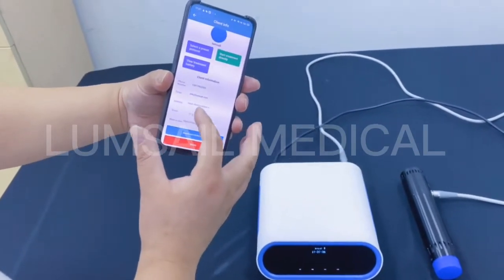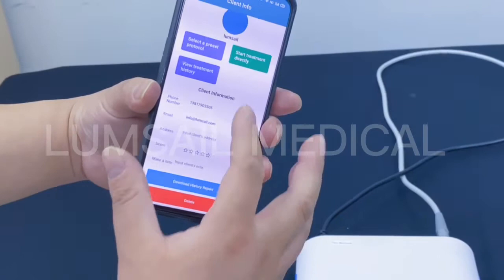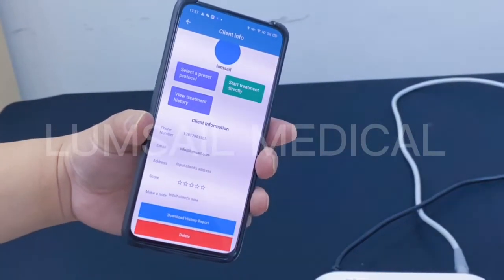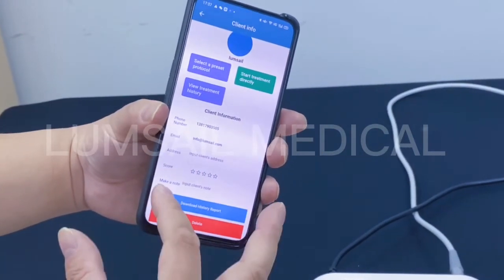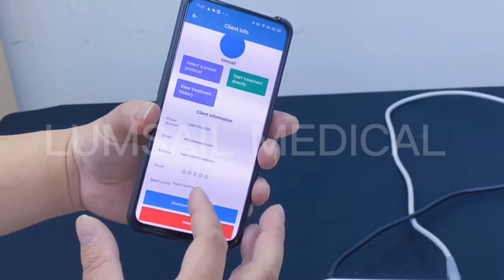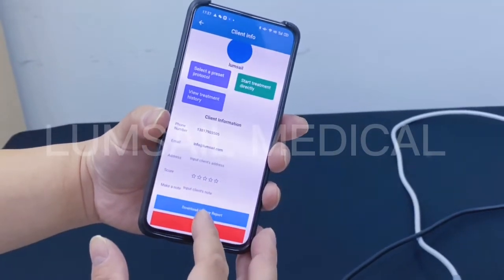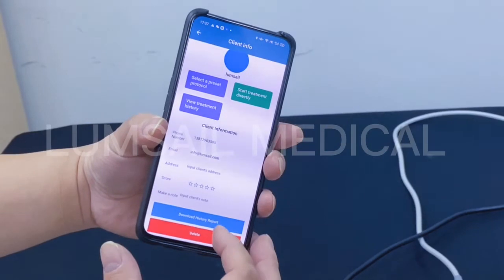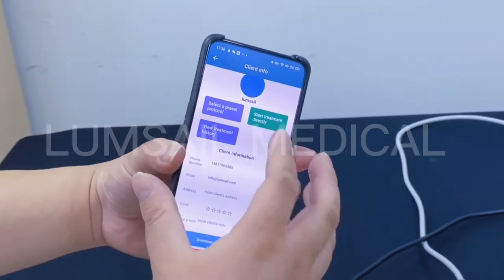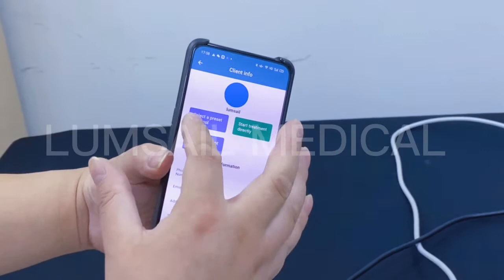With this client you can see you can record the phone number, the email, and the physical address. You can also give a score to the client as you like, and there is a notes field where you can input client information. You can also download the treatment history report as a PDF file.